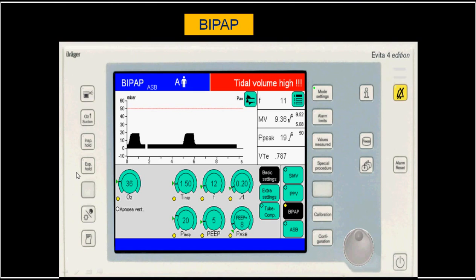Let's look at the Drager machine settings. The high CPAP is the inspiratory pressure P-high, and the time for the high CPAP is set — for example 1.5 seconds. The lower CPAP has no direct time setting; instead you set the frequency. For example, 60 divided by 12 gives about 5 seconds total cycle, so with 1.5 seconds inspiratory, the expiratory time would be about 3.5 seconds. You set the high CPAP, the time for the high CPAP, the frequency, and the low CPAP.